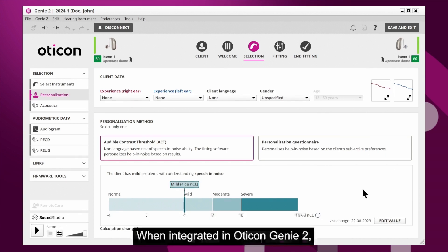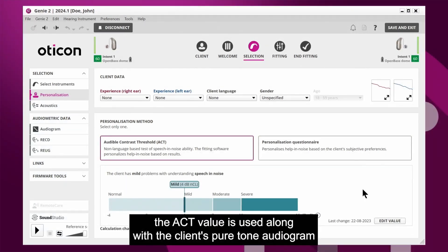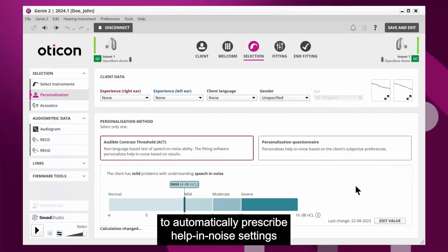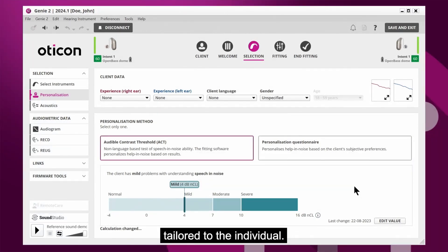When integrated in Oticon Genie 2, the ACT value is used, along with the client's pure tone audiogram and to a lesser extent their age, to automatically prescribe help in noise settings tailored to the individual.